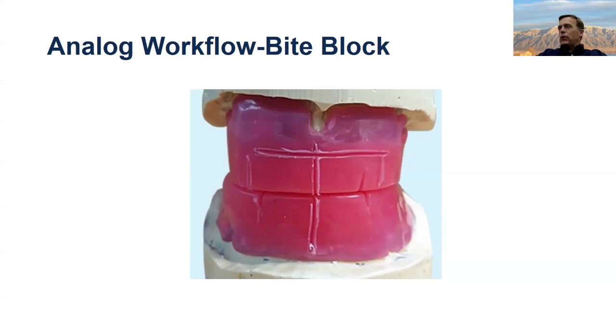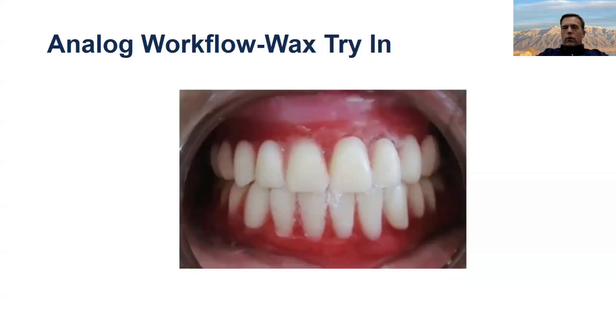Once you get the wax shaped up where you want it, if you're doing a double arch, trim the maxillary arch so that the plane of occlusion looks really good, and then carefully trim the mandibular arch until the person achieves the correct vertical dimension of occlusion. Once you know where that is and it's repeatable, you can go ahead and cut some retentive grooves in the occlusal surface of the bite blocks, put a little bite material in there, and have the person bite together, asking them to try to touch in the back. As you know, that'll help them get to a CR position. Send that to your laboratory. Your laboratory will go ahead and articulate the case with your bite block and then set the denture teeth in wax based upon the guidance you've given them.